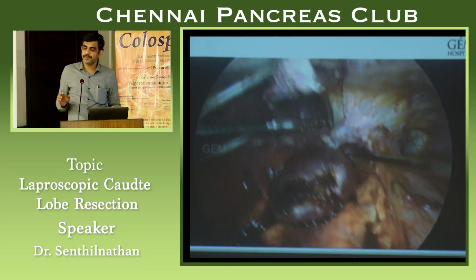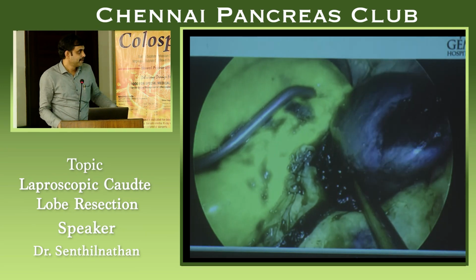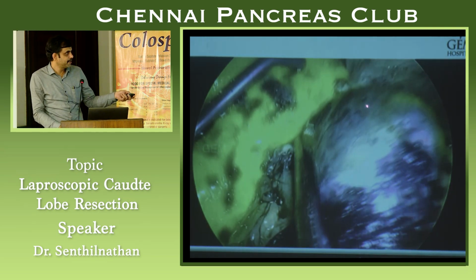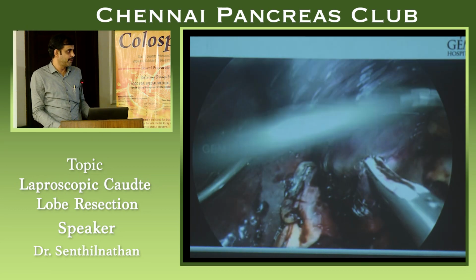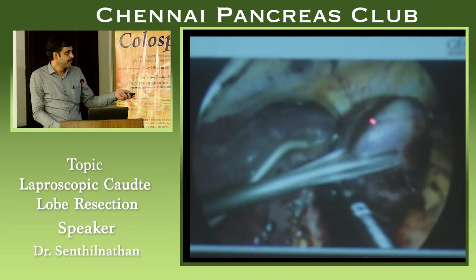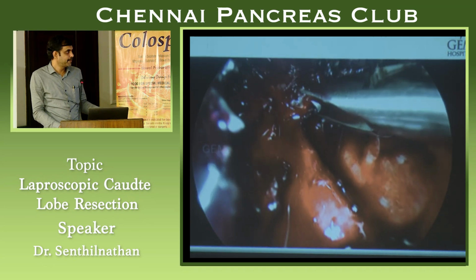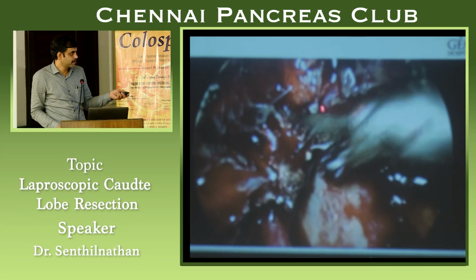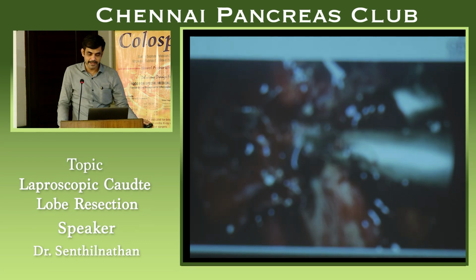So here it requires a lot of patience for the surgical crowd, I say. You can see the ICG being given, and we can see this is the portion where it still has a little bit of inflow, meaning the portal blood flow is still there. By that we can assess how far we have to go with regards to the inflow control. So it's called negative staining with ICG.